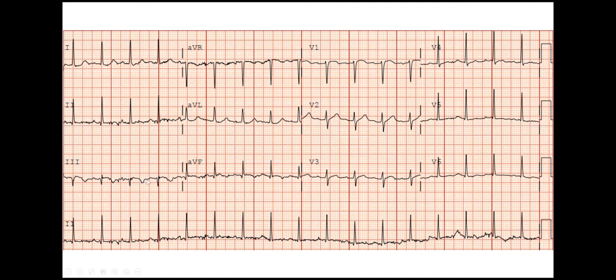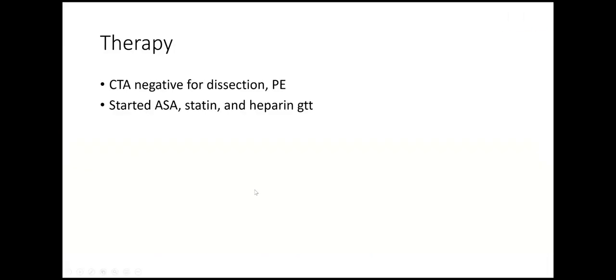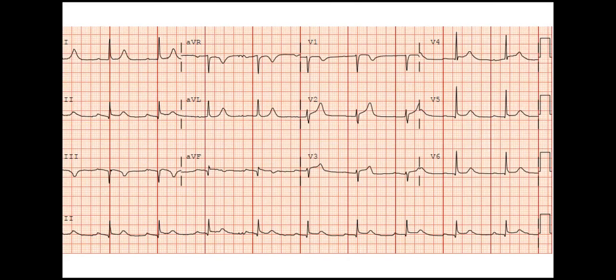look at lead 3. I called it like a Wellens equivalent, almost biphasic. And the troponin was 76. I argued that this patient was actually a STEMI that they missed. People were upset with me. I was yelling at the fellow, why didn't you activate? But in any case, the story does not end here. So I took the patient to the cath lab, of course.